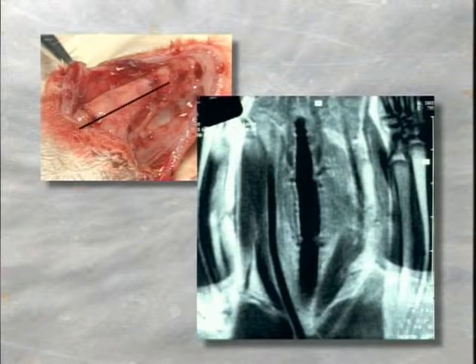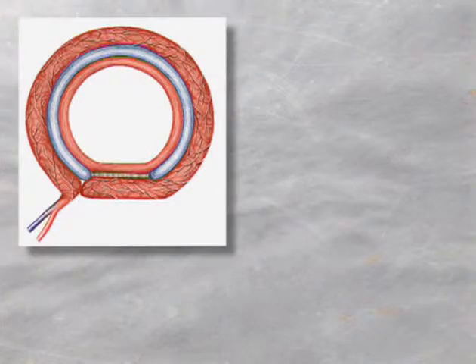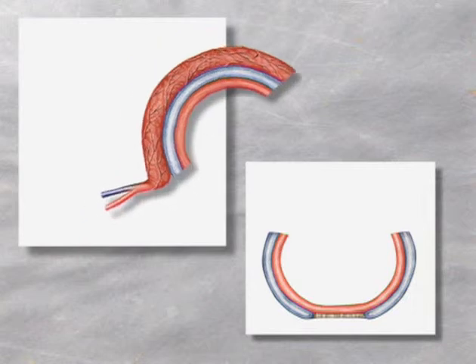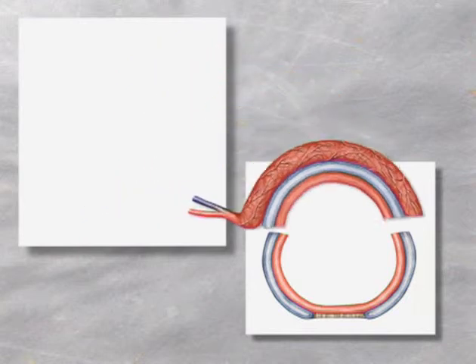A revascularized allotransplant in an immunosuppressed receptor can not only be used for segmental transplantation, but can also be transformed into a patch after removal of the membranous trachea. The tracheal patch can be used as the optimal tissue in repairing anterior airway defects.